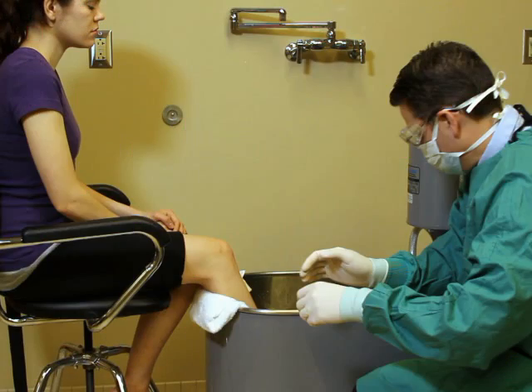Position the patient comfortably with the affected area immersed in the water. Dry padding such as a folded towel may be placed on the rim of the tank to distribute pressure. Do not allow the patient's fingers or toes to be near the turbine ejector.